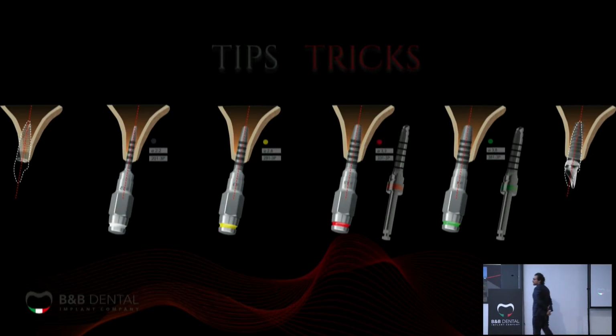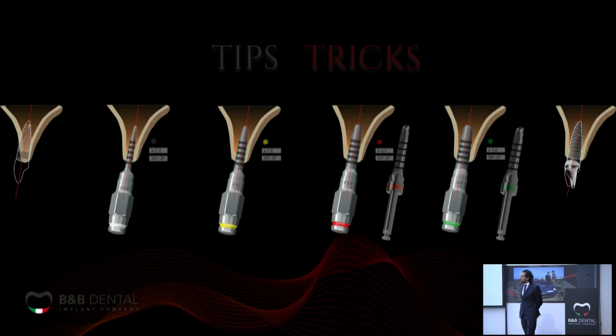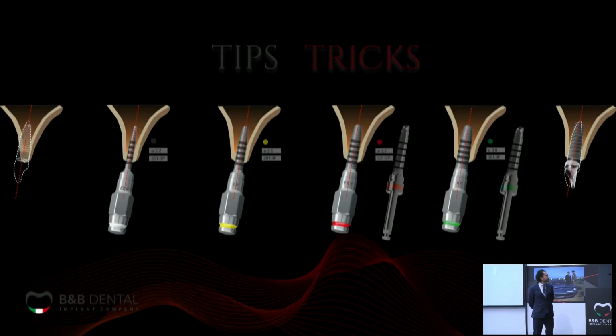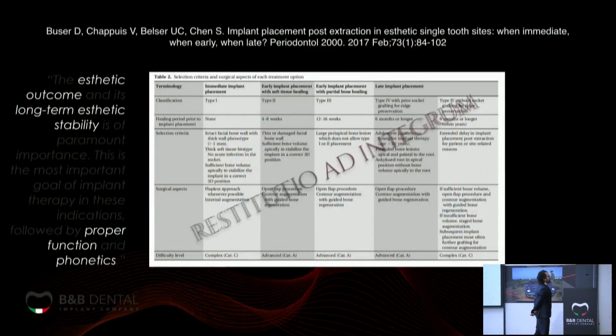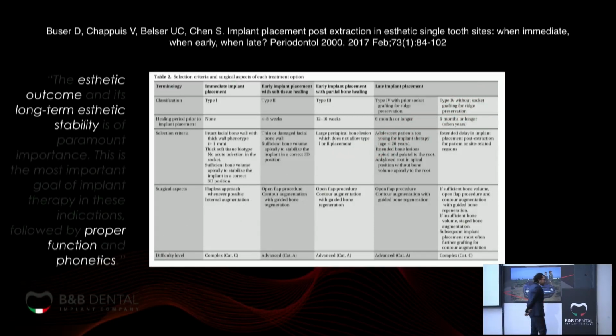Then we talk about some tips and tricks about these techniques. We talk about how to use the expanders, how to design a flap, and how to suture in daily practice. But let's go back to our topic.